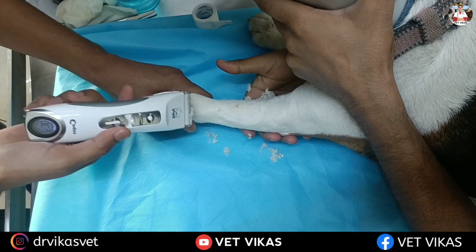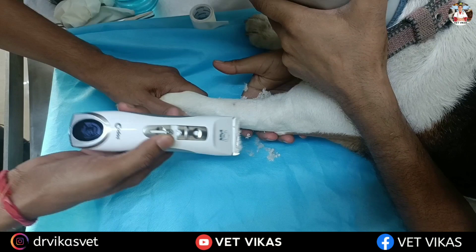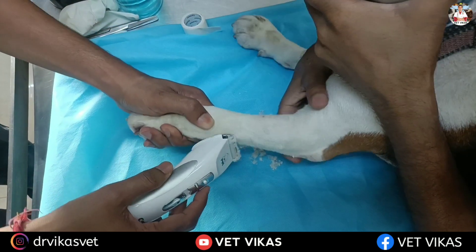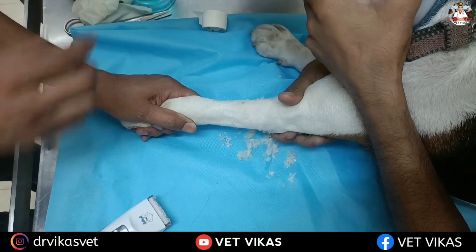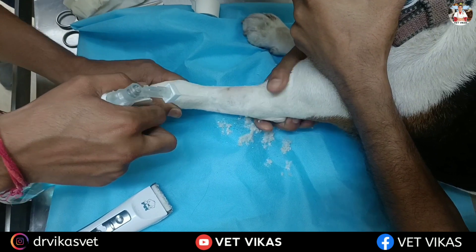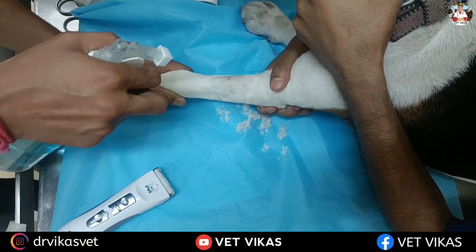Now we will talk about the procedure. First we have to clip the hairs at and around the site of IV cannula for proper aseptic procedure. After that we have to sterilize the area by using a spirit swab or povidine iodine.